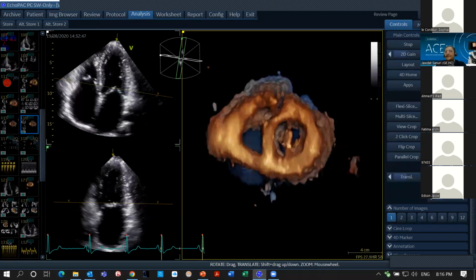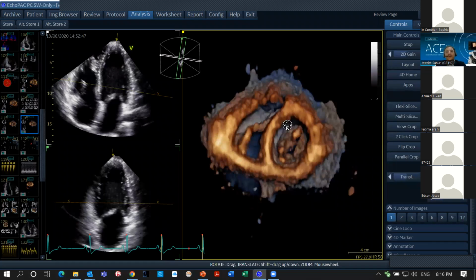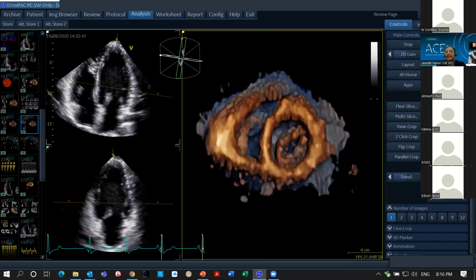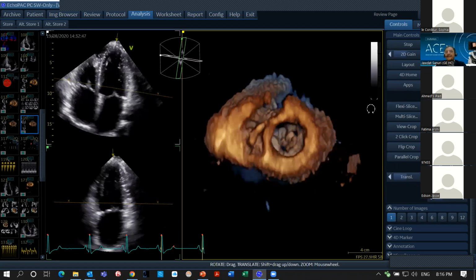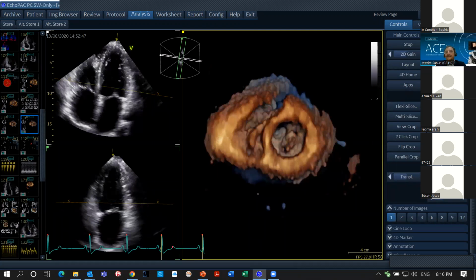When it's low, then it's more grainy speckles of the 4D. I believe it's just like the UD clarity. The UD clarity is the ultra definition clarity, and this is for 2D grayscale, making it also smooth versus contrasty. Okay.